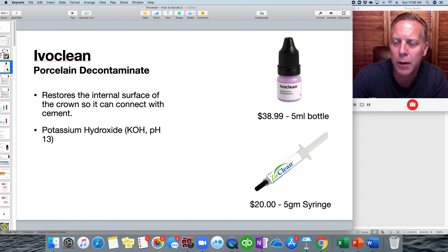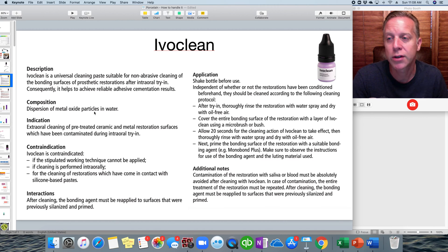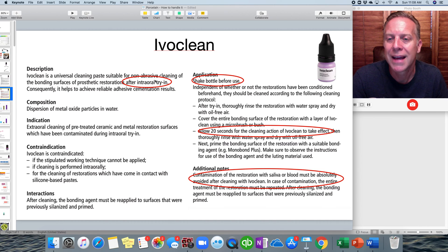The main active ingredient in Ivoclean is potassium hydroxide. Ivoclean is the most popular brand right now, though there is also one called Zirclean used on the internal of zirconia restorations to remove phosphates from the receptor sites. The key point is that you place Ivoclean after you've tried the crown in the mouth — once you've confirmed the contacts look good, the x-ray shows it's sitting on the margins, and it flosses well. Any time saliva is introduced into the crown, you must remove that contaminant, and that's where Ivoclean comes in.